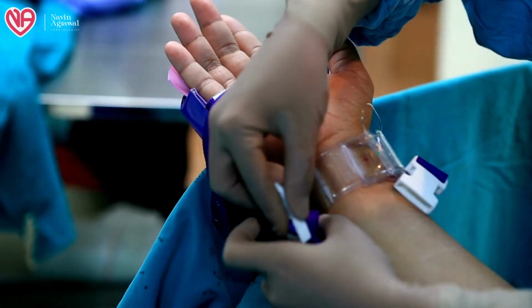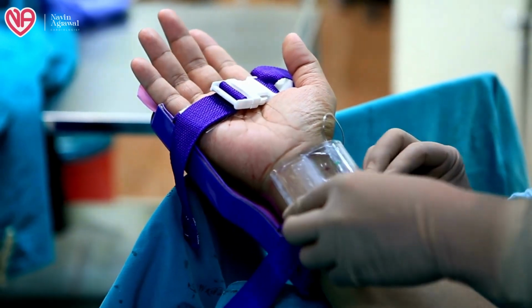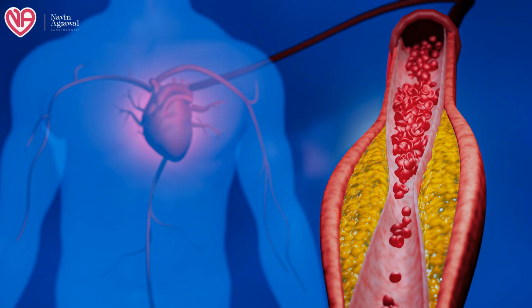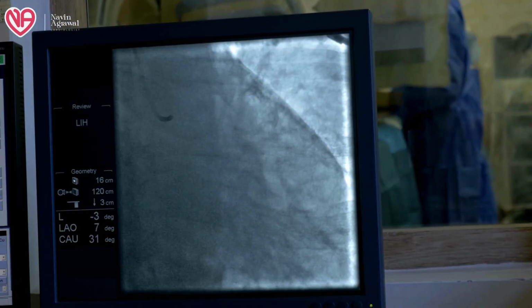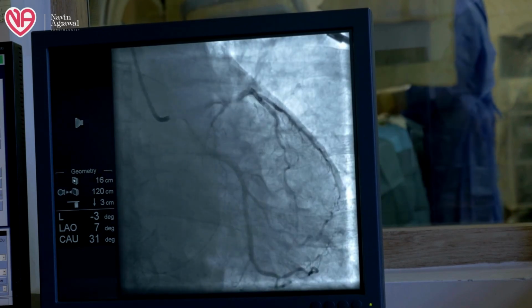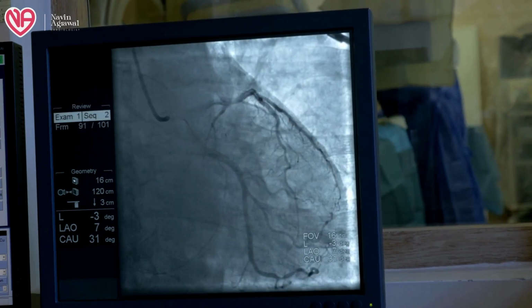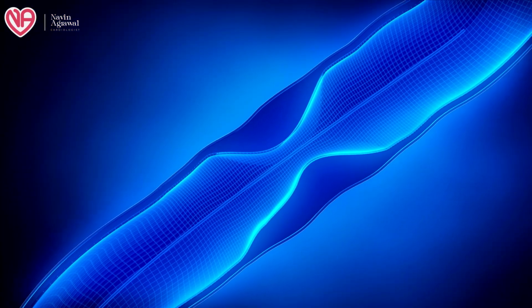Conventional catheter angio is preferred whenever the patient is high risk, or where we are almost sure that the patient is more likely to have a coronary artery disease. Therein we need the patient to get admitted and we perform a conventional angio, because in this case we need an absolutely certain report whether the patient is having a blockage or not, and if the blockage is confirmed, then using the same catheter and wire we can pass a balloon and deploy a stent also and treat the patient in the same sitting.